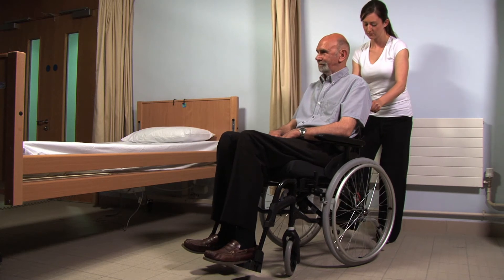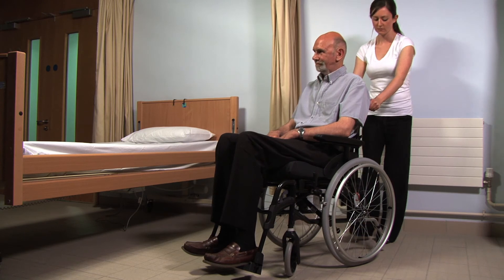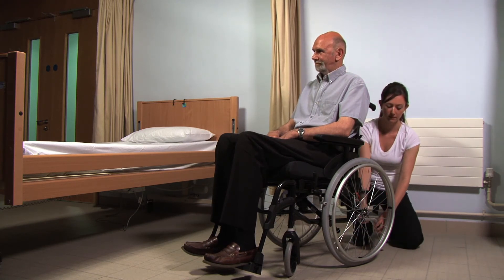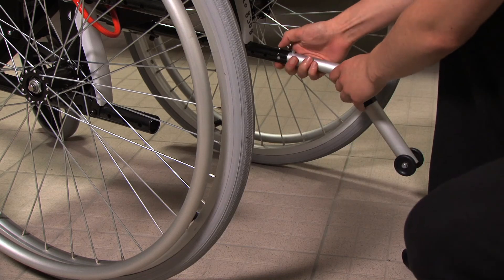The anti-tip bars at the back stabilize the wheelchair and prevent the chair from tipping backwards. These can be removed when tipping is required, for example when moving up or down curbs. The remaining bar can act as a lever to assist with elevating the chair for this manoeuvre.